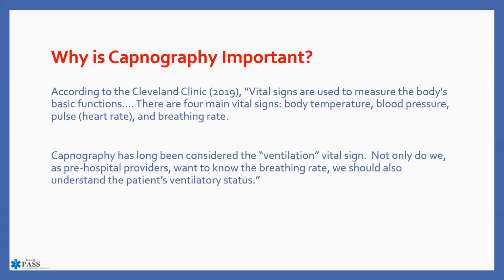But capnography has long been considered the ventilation vital sign. So why do we not use that more frequently as pre-hospital providers? We obviously want to know the respiratory rate and what else is going on with the 4 main vital sign groups, but we should also understand what the patient's ventilatory status is. So there's a lot more to be said than the patient has a respiratory rate of 12 or 16. We really need to know how well they're actually ventilating. And it kind of goes back to some other topics that we've talked about in the past.